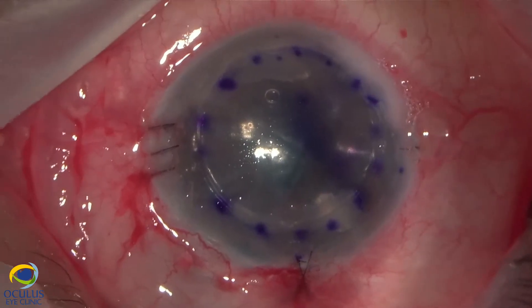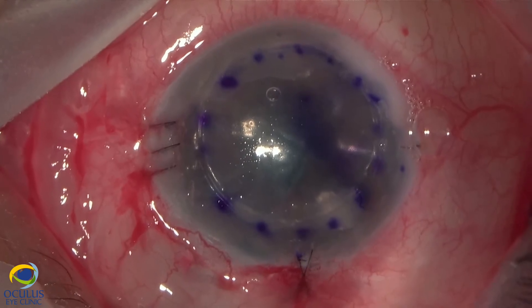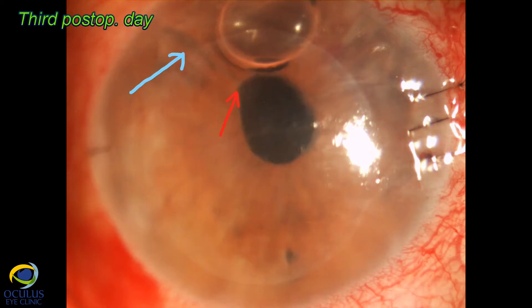We sutured the incisions and by gentle massage centered the DSEC lamella in its final position. We leave a pressure of about 30–35 mmHg at the end of the case and check the eye after one hour.